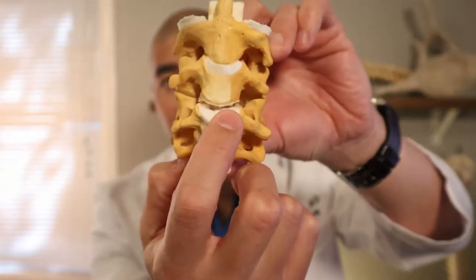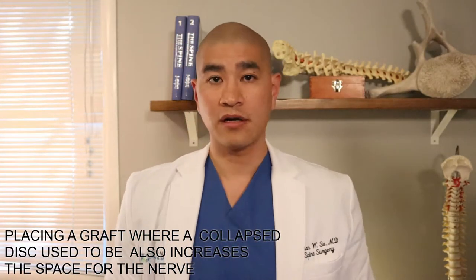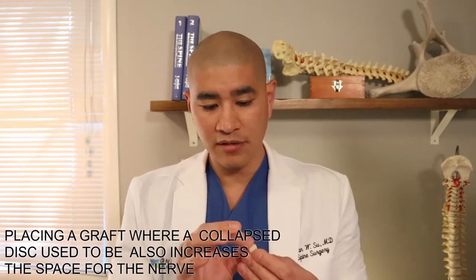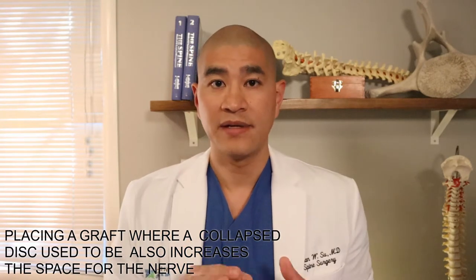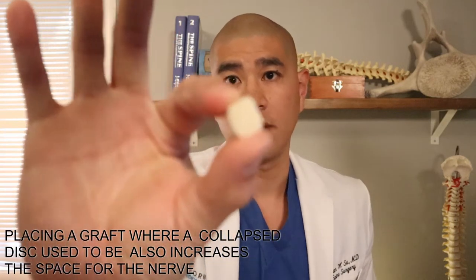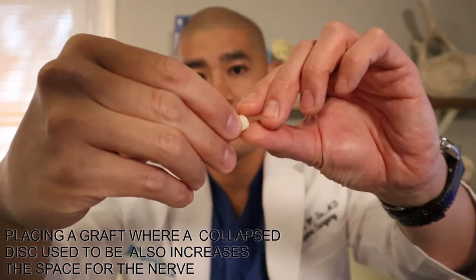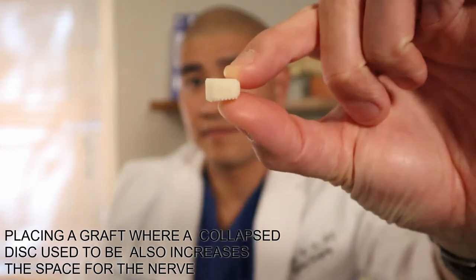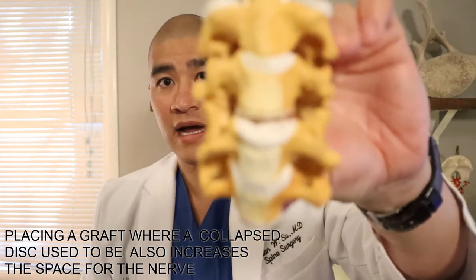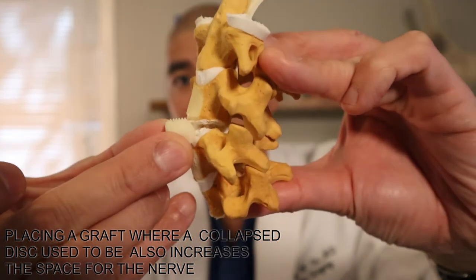After we take the disc completely out, we have to put something in its place. There are two different options. One is something called structural allograft, which is donated cadaveric bone. This is literally bone donated from a cadaver that has been irradiated, meaning it doesn't carry disease. It's very small — about the size of a disc — and after there's a space, we take this implant and insert it into where the disc used to be.